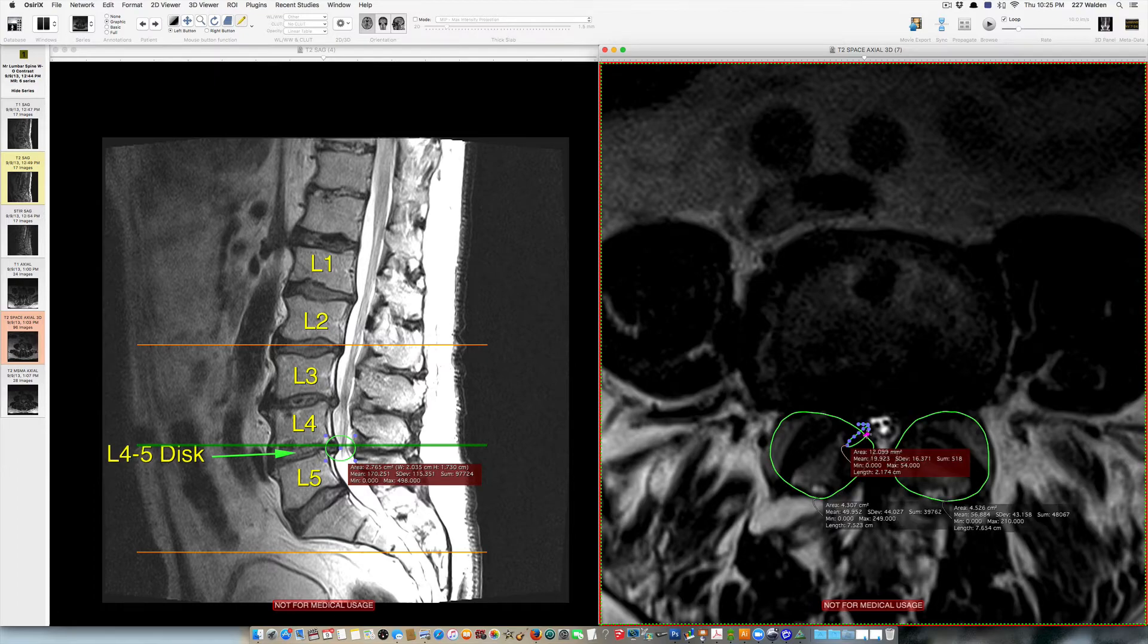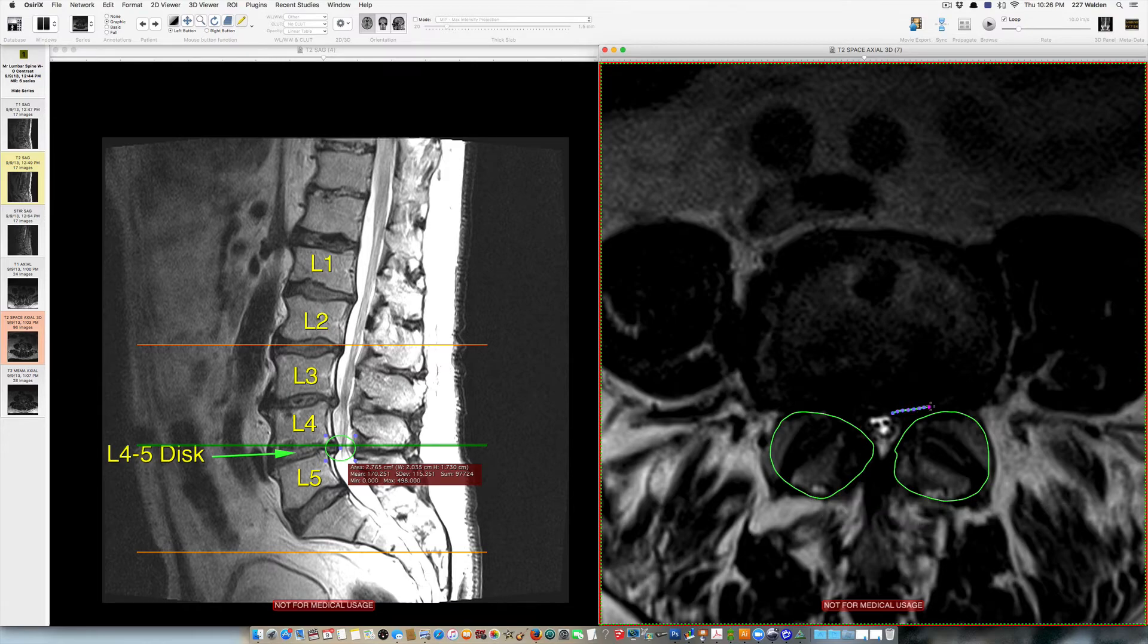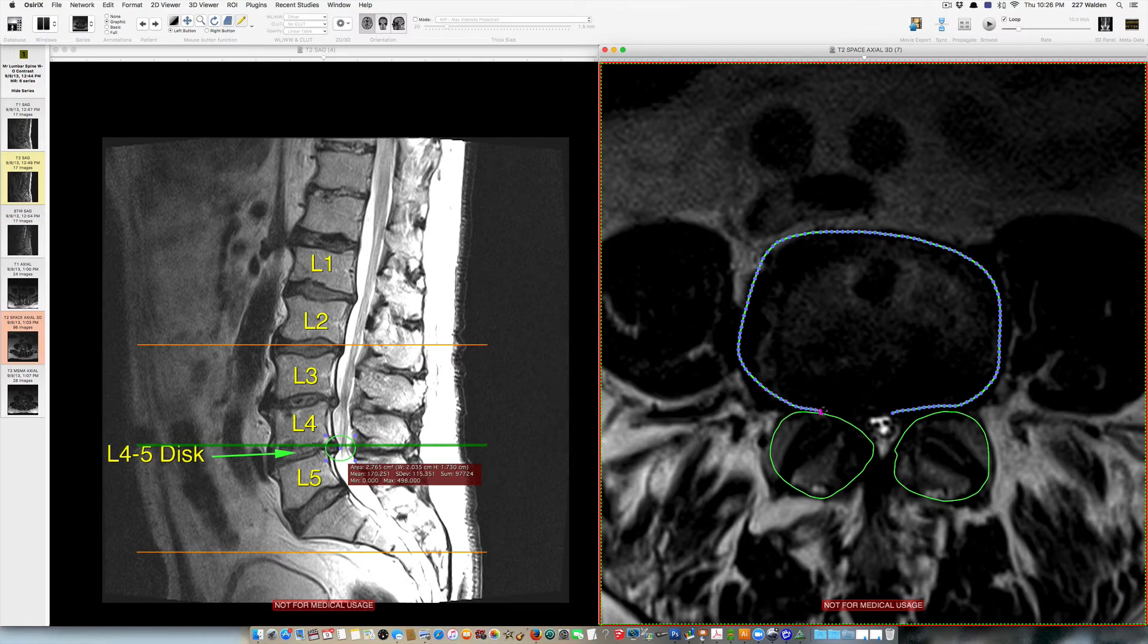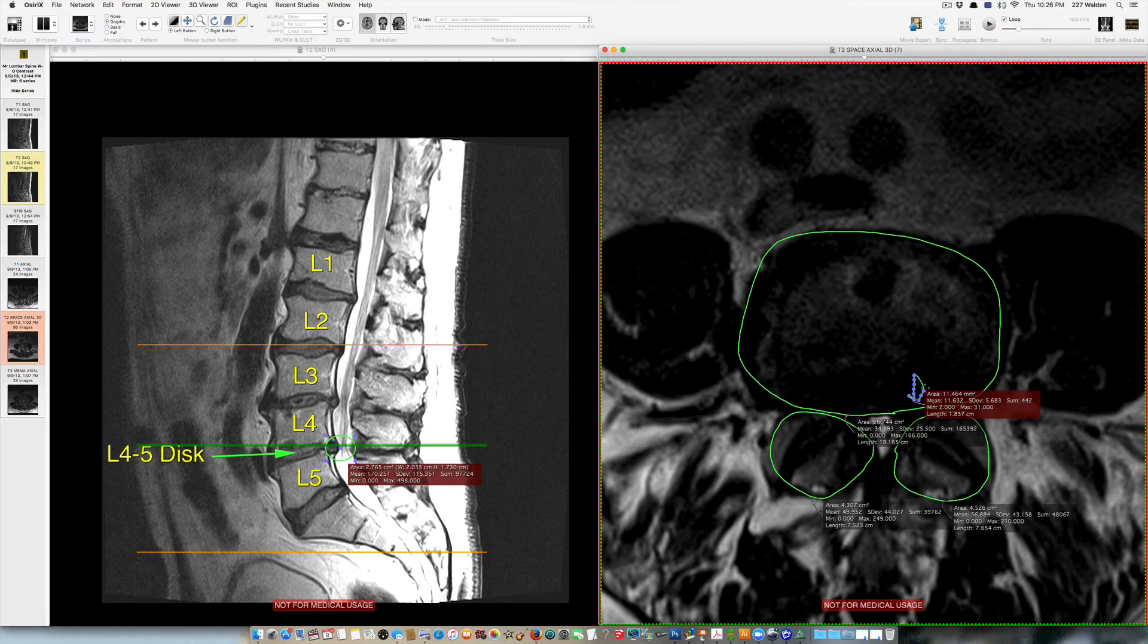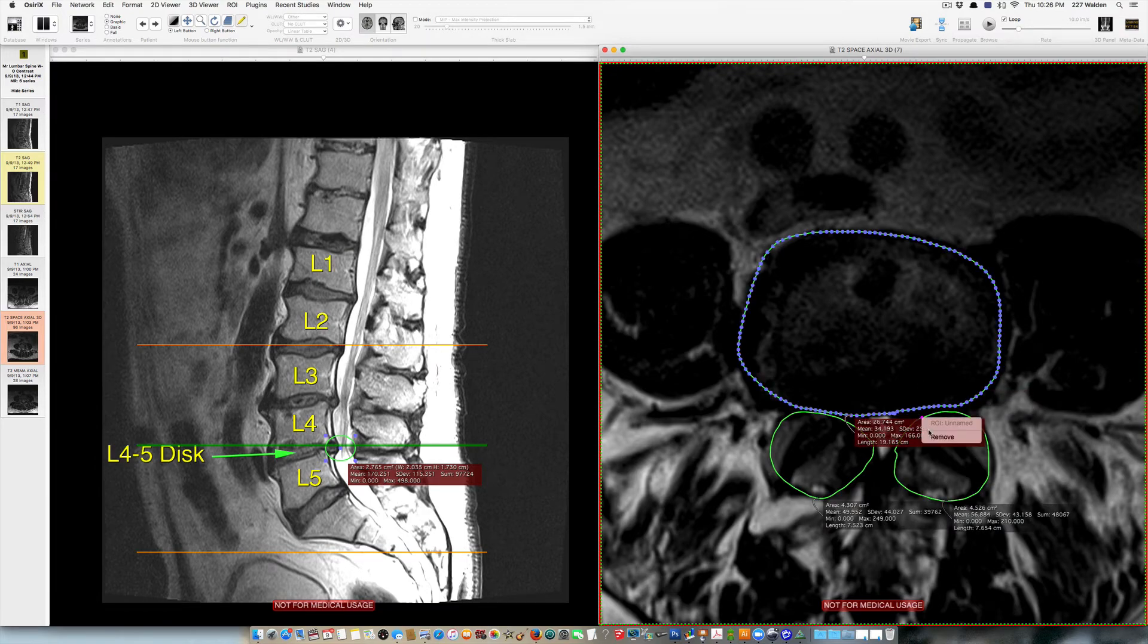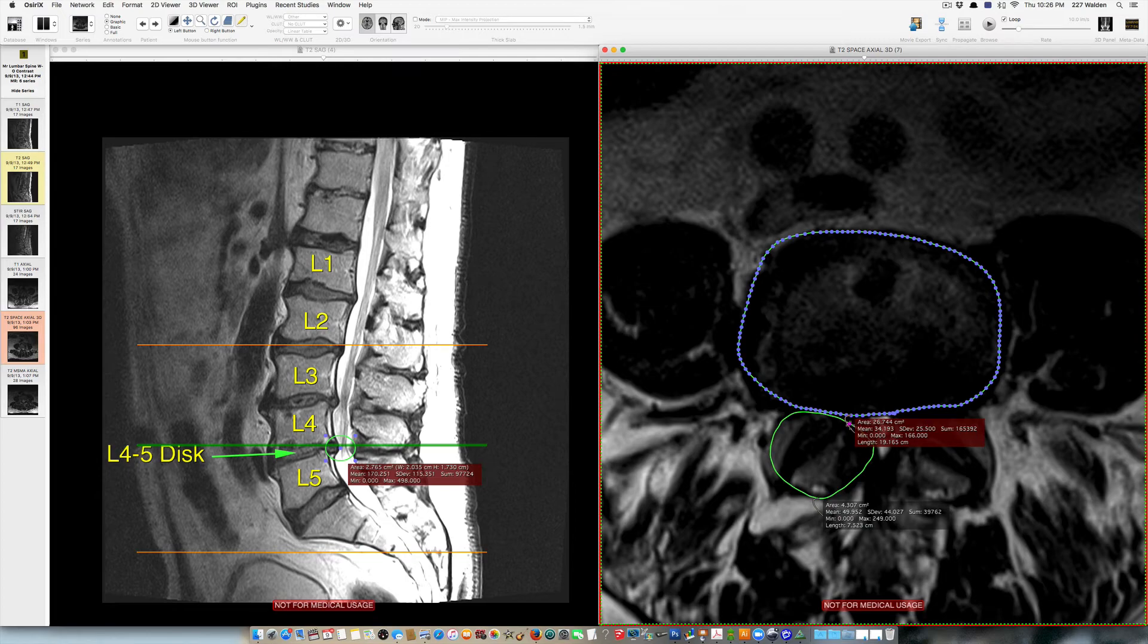So we're just going to delete those to make this a little bit more easier to read. And then a broad base disc bulge which develops here encroaches upon the spinal canal this way. And it's the combination of both those factors there that cause spinal stenosis.